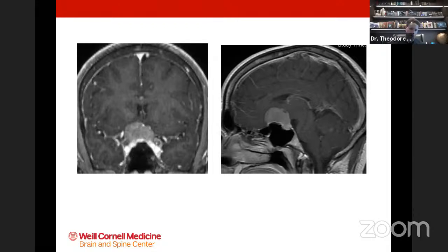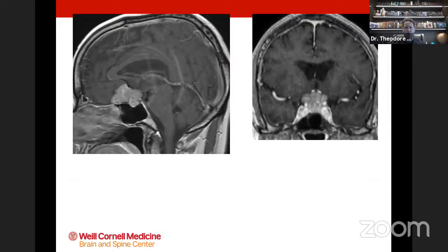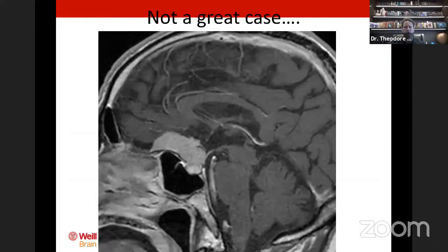These are just some other examples, preoperative MRI, postoperative MRI, showing you gross total resection, radiographic gross total resection of the tumor. Another preoperative MRI, you can see the A2 branches right on the back of that tumor there. And then post-op, the tumor gone, chiasm decompressed. This was an interesting case we did of a meningioma within the third ventricle, which we took out endonasally. Again, it's a great approach to go up the long axis of the tumor.